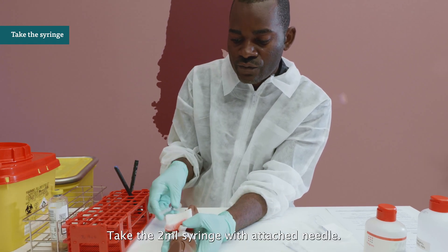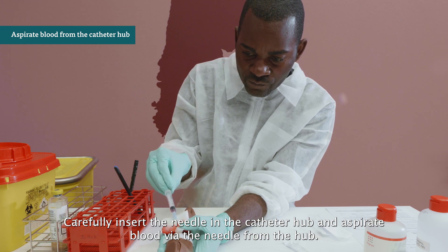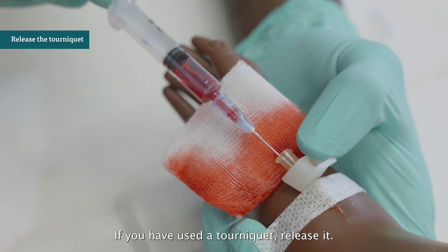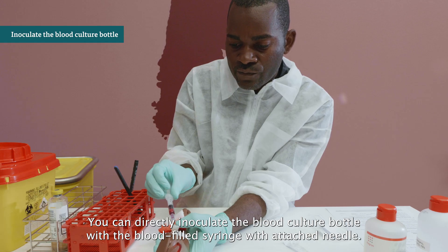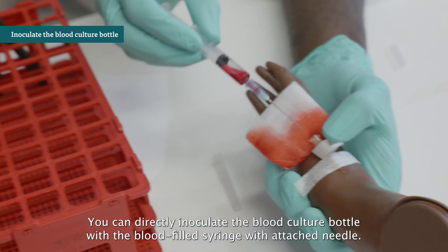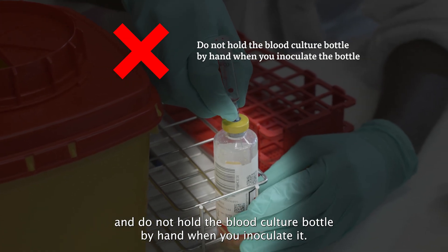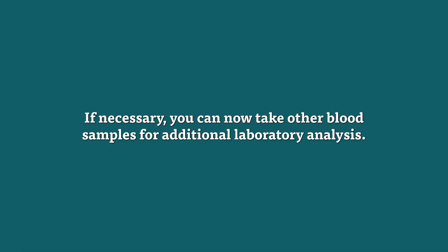Take the 2 ml syringe with attached needle. Carefully insert the needle into the catheter hub and aspirate blood via the needle from the hub. Aspirate blood until you have collected the volume required for the age of the child. If you have used the tourniquet, release it. Press on the vein just above the puncture site to stop the blood flow. You can directly inoculate the blood culture bottle with the blood-filled syringe with attached needle. Make sure the blood culture bottle is placed in a rack — do not hold the bottle by hand when you inoculate it. Carefully puncture the septum of the blood culture bottle and the blood will flow in. If necessary, you can now take other blood samples for additional laboratory analysis.